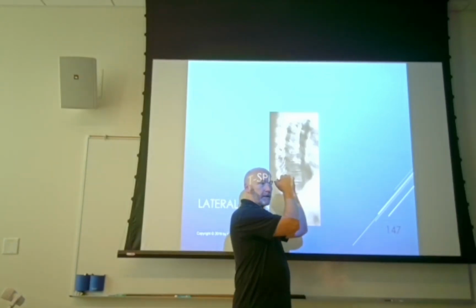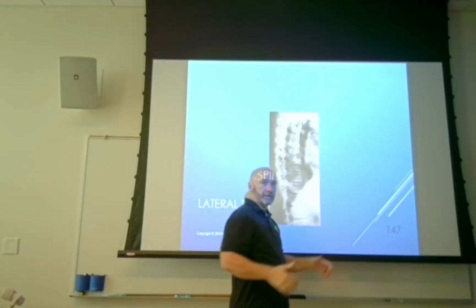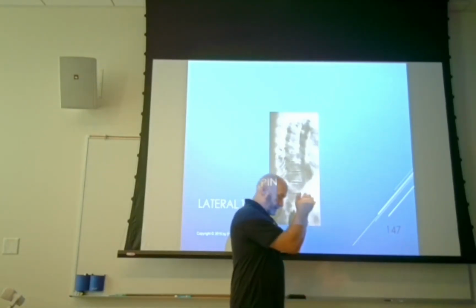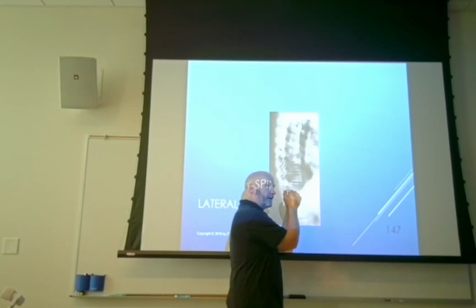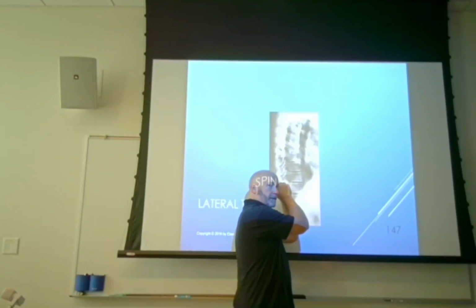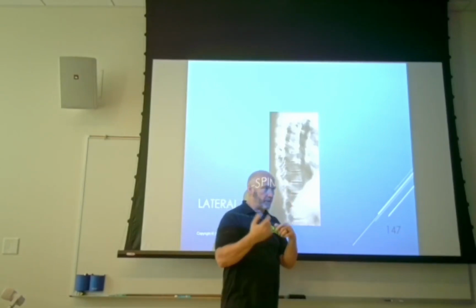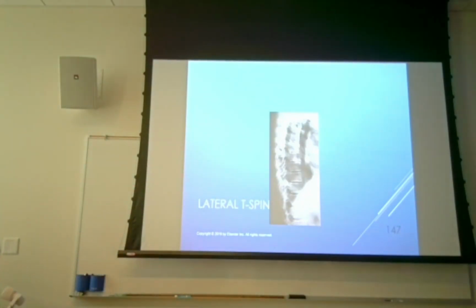So get the patient into the lateral position, and then oblique either towards the image receptor or away from the image receptor, and make sure you move the patient as a whole, right? Don't leave the knees stacked and just rotate like that. You're going to have to unstack the knees a little bit and rotate them. Okay, so 70-degree oblique, central ray is going to be in the same spot.